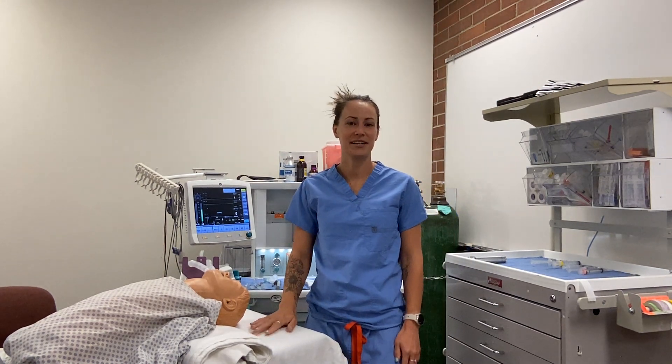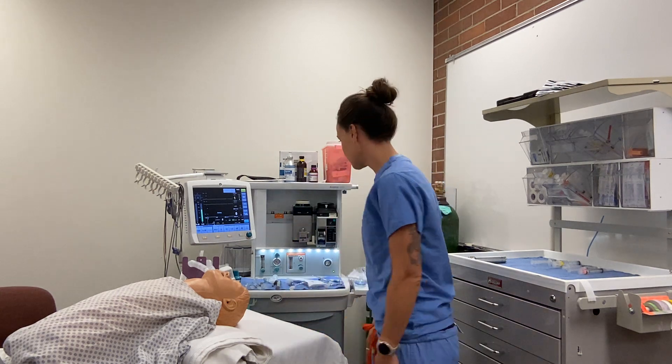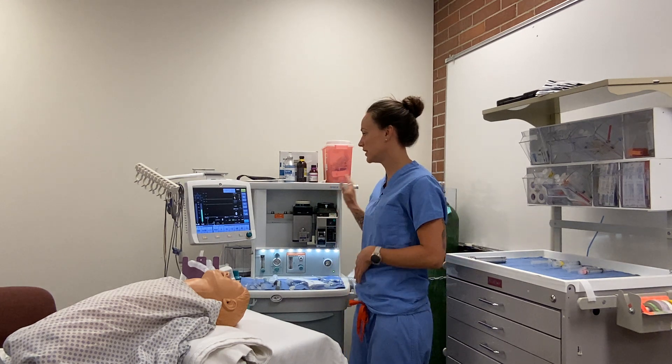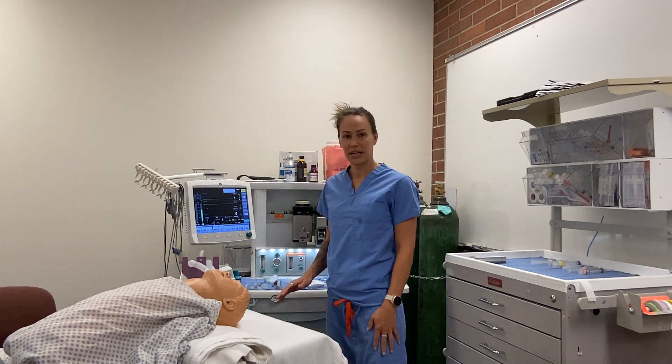Hi, my name is Chelsea Christensen and I'm going to go over an inhalation pediatric induction. Before the patient comes into the room, I'm going to check that I have all the monitors that I need, do a machine check, and check that I have suction that's working and on.